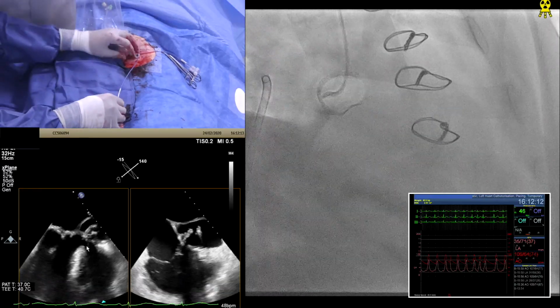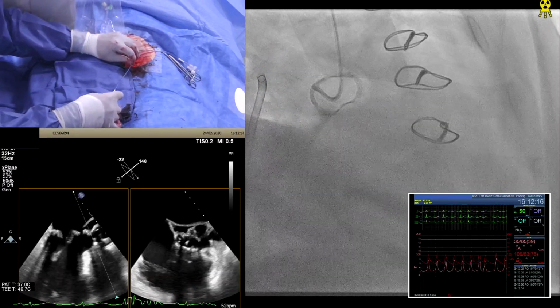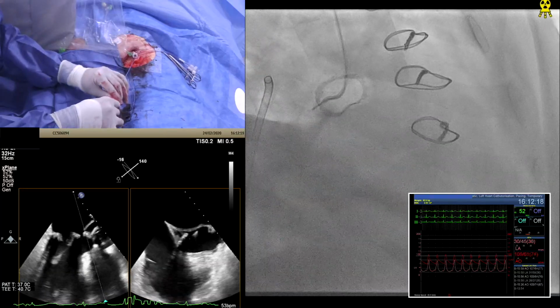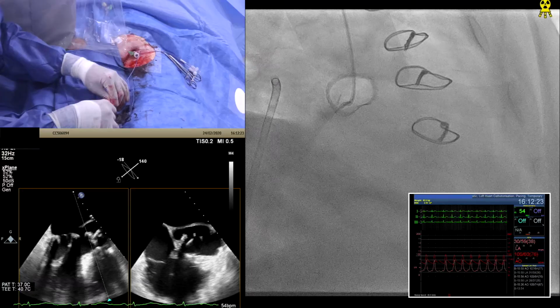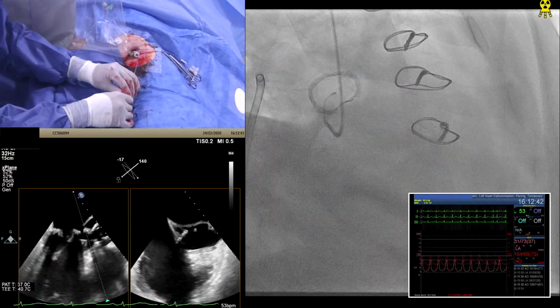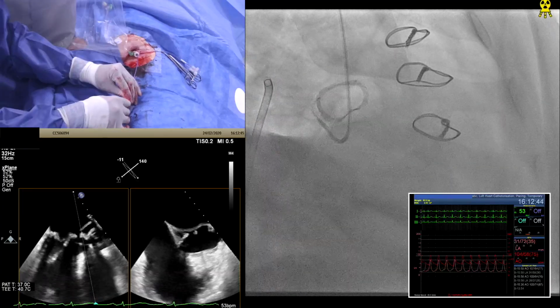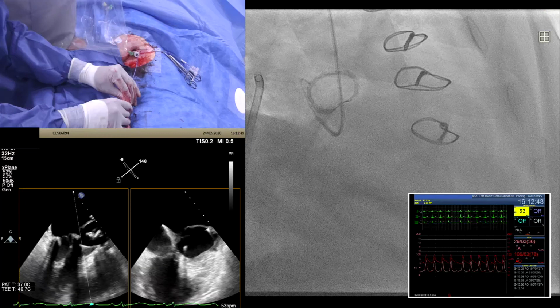So it's still too low. So I'll rotate again. It's still caught, isn't it? Yeah, you're still in that space. So I don't want to push too hard in that space. Now, this is looking better. This is lower. And if I rotate, now that's very close to where I want to be. Yeah, you're coming back gradually. Can you see you're curving in the right direction?